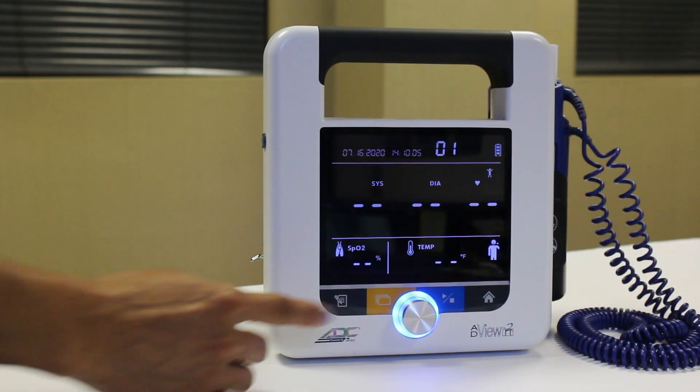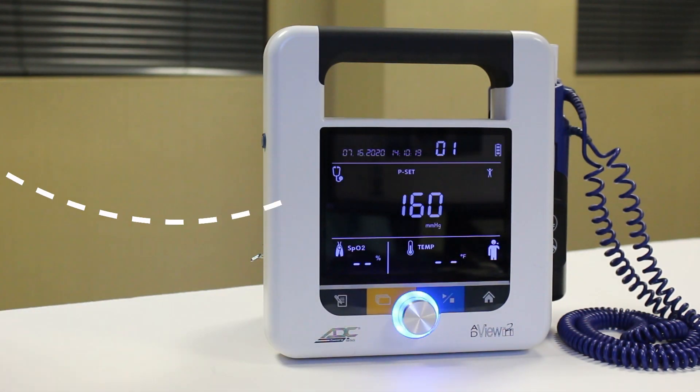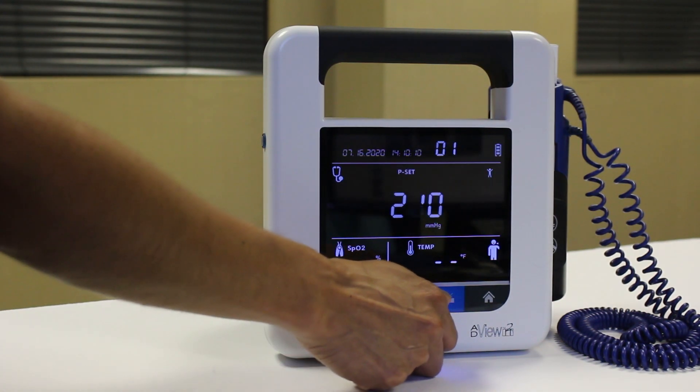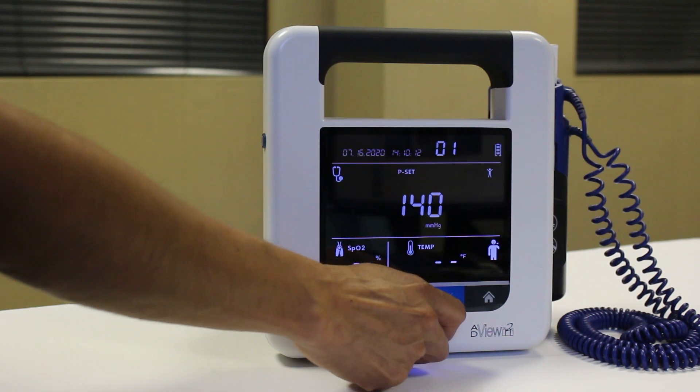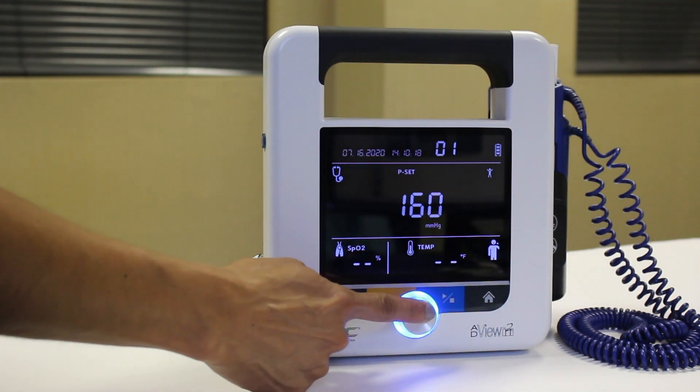To take a manual blood pressure reading, press the mode toggle button until you see the manual mode icon. The pressure setting icon and selection knob will flash. To keep the default maximum cuff inflation setting of 160 mmHg, press the knob. Or choose another pressure level between 100 to 280 mmHg and press the knob to select. The device will remember that pressure setting the next time manual mode is used.